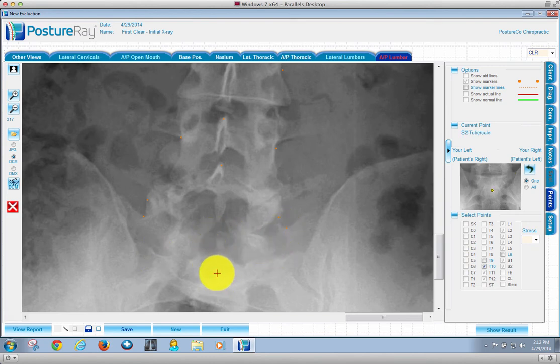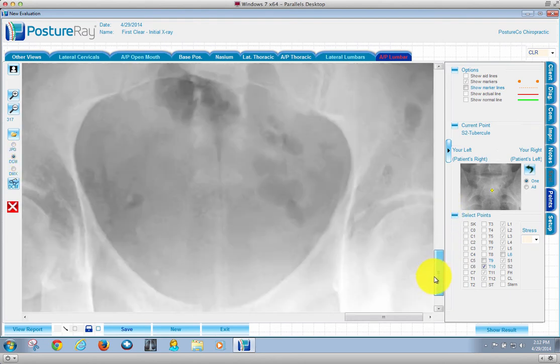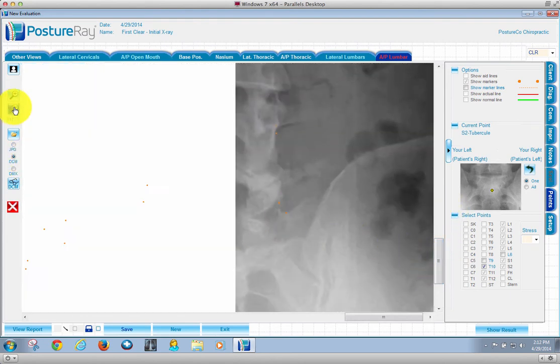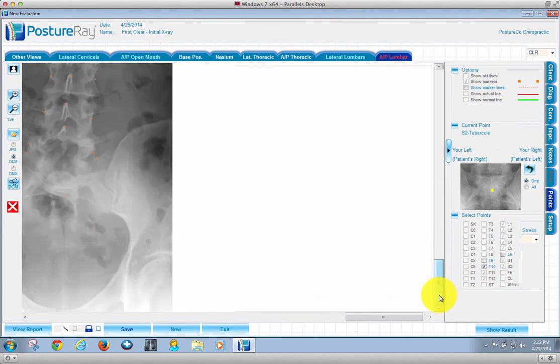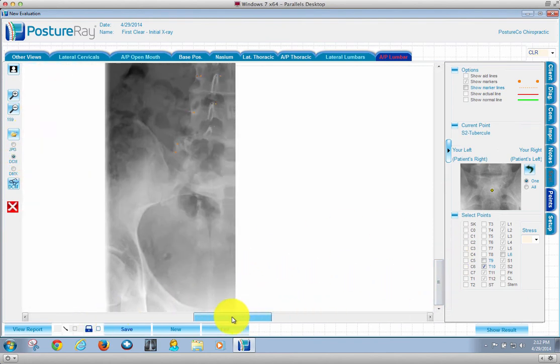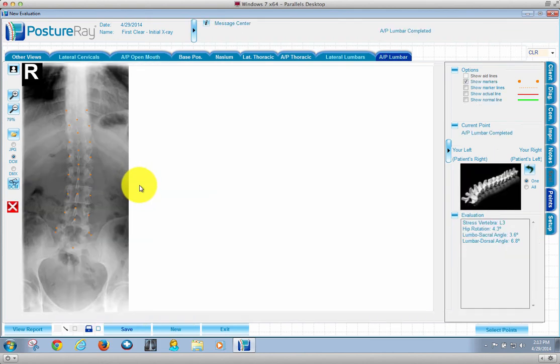Then what we're going to do is we're going to hit the S2 tubercle, which is right here. Let's go ahead and let me zoom out here. Go down so we can see a little better. Move over just a little bit here. There we go. Now I'm going to go ahead and just estimate there.